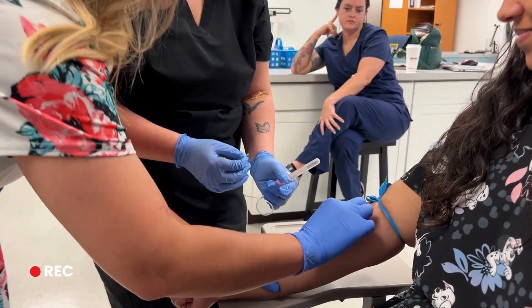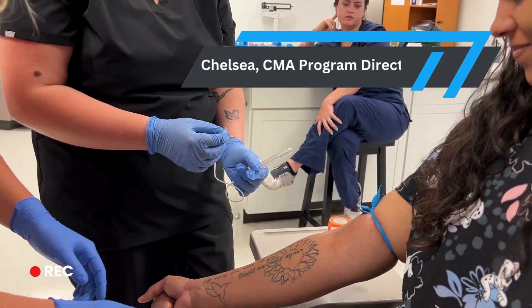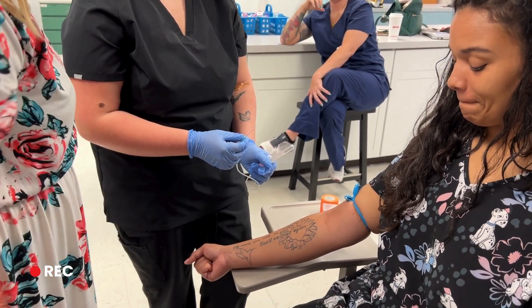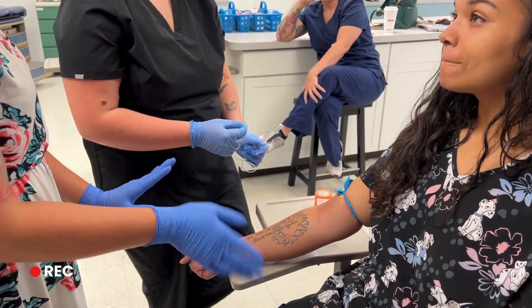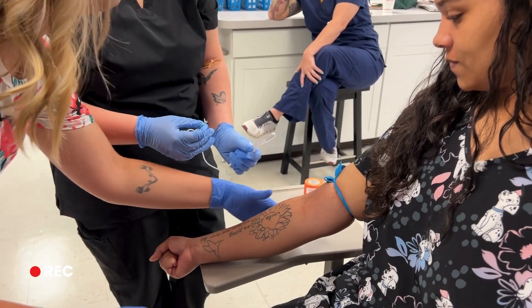Here's our ring — see, I'm wiping it. Wipe it, let it dry. Don't fan it. We don't want to fan it because it could blow bacteria onto the skin. Okay, ready? Take that thumb, you're gonna hold it down.